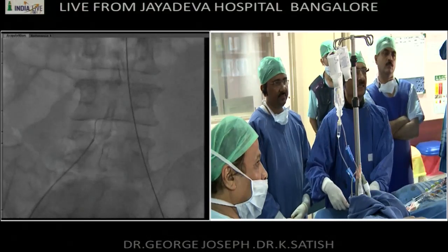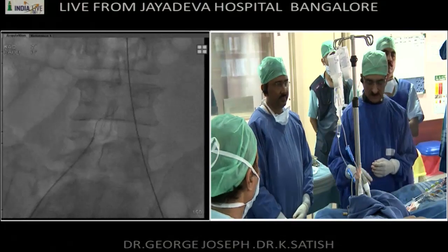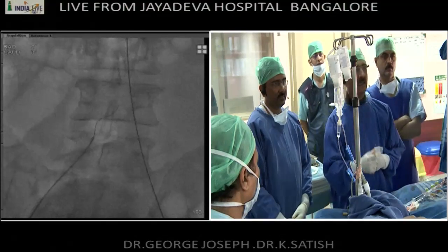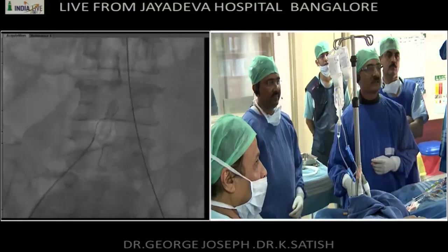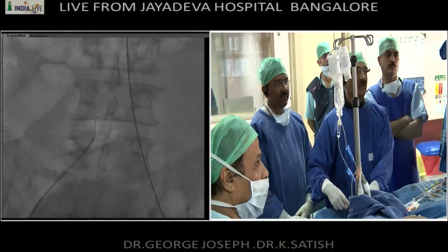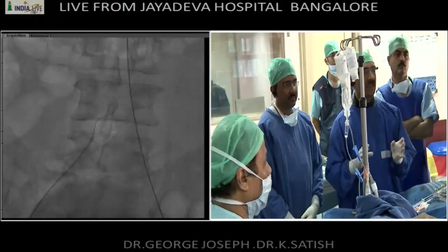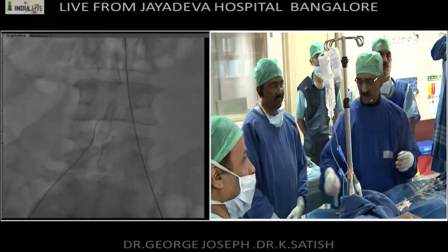This O35 wire, pardon? Retrograde, no. Antegrade, yes. So I have actually almost reached the proximal cap with the wire, and I have not fallen in, and I am seeing this curving of the hydrophilic wire. So that is a sign that we are likely to raise a flap if I push some more. So I'm not going to persist with that.